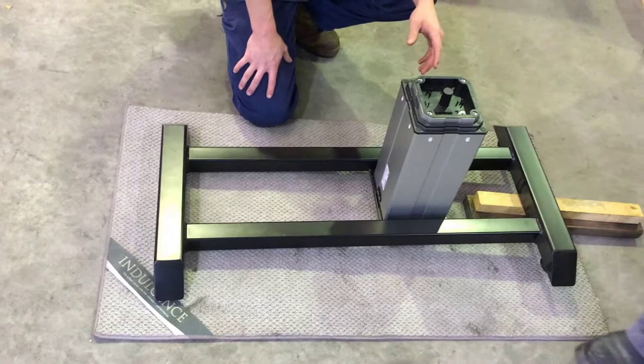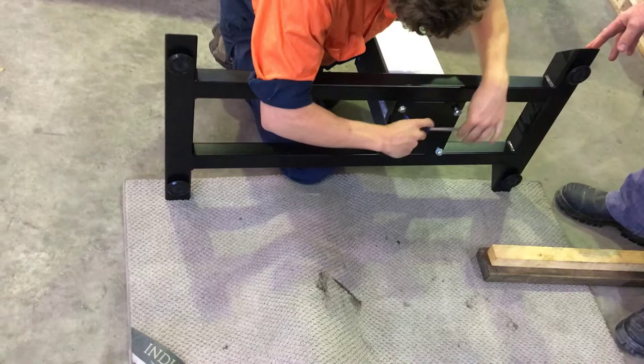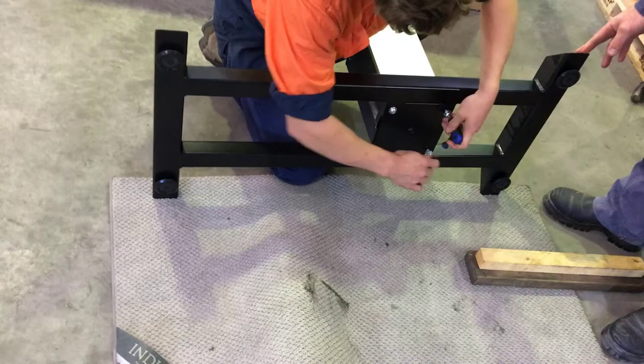Once we've got it just to finger tightness, we'll then take the unit and lay it onto its side to get access to the bolts from underneath. From here we're just tightening the tension to make sure it's actually tight enough that the vibration of the table won't cause it to come loose.